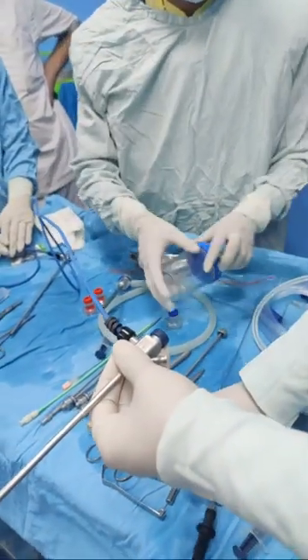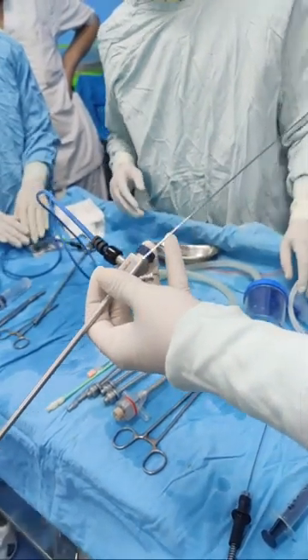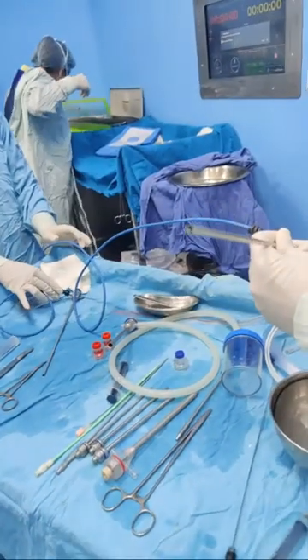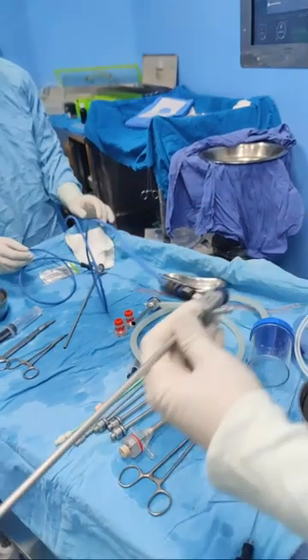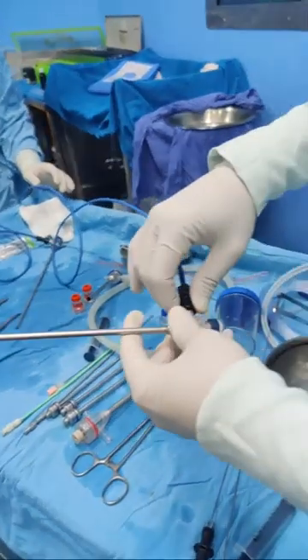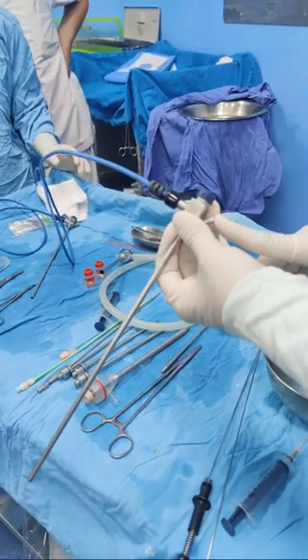Suppose you want to use a forceps, where is the pneumatic probe? So this is the probe that is coming here. It will always come at the 6 o'clock position. You can use a triprong forceps, biprong forceps, and this is all one part. This is not dismantlable, it is a fixed thing. And from here the instrument goes, from here the irrigation goes.